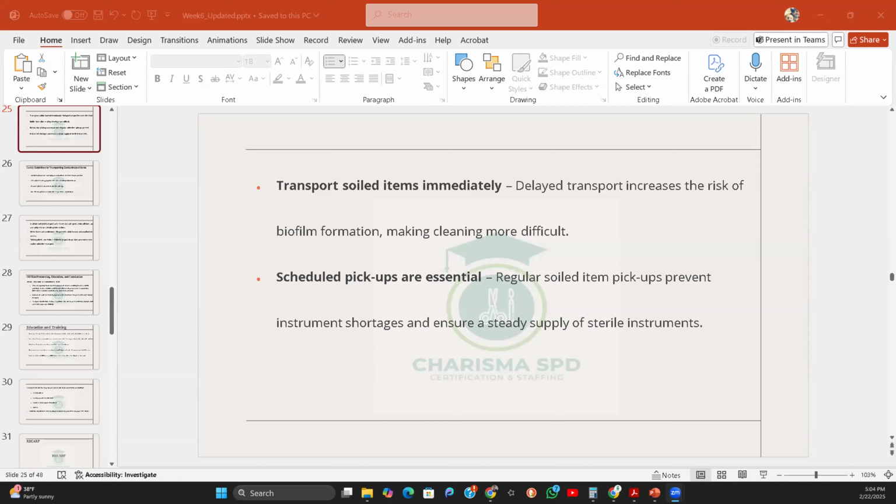There are some instruments, under certain conditions, if the manufacturer recommends, that you can clean and use on a patient. That is if it does not invade the body, but we'll get to that. What you have to understand at this point is that the case cart is not really medical equipment. It's not used on a patient. It's just used to carry equipment that is used on a patient. If you think of it like that, it will make sense to you.